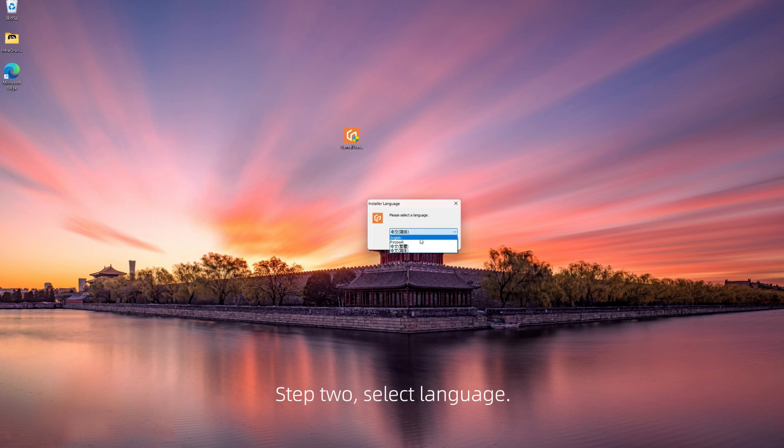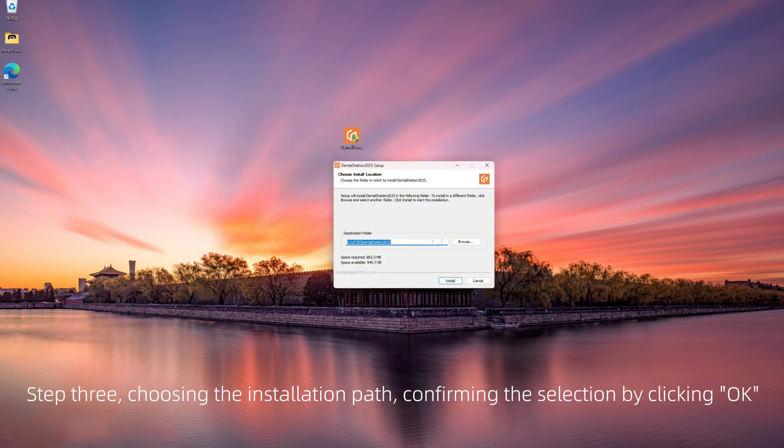Step 2: Select language. Step 3: Choose the installation path and confirm the selection by clicking OK.